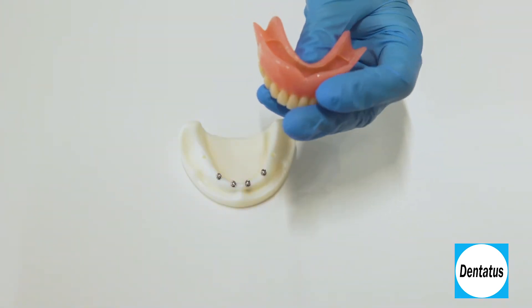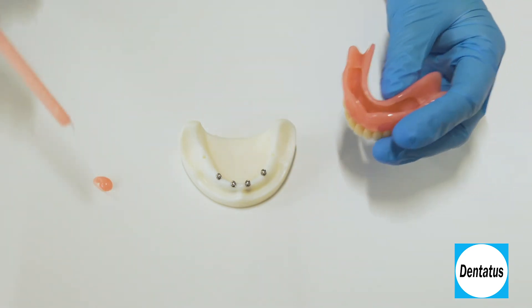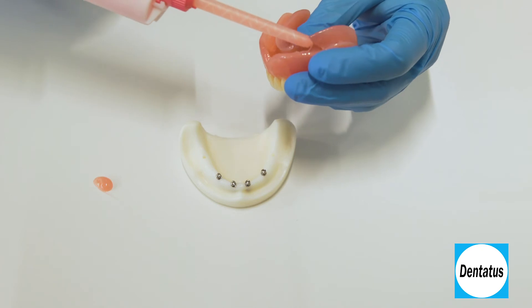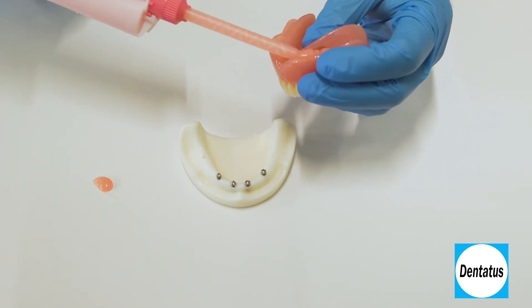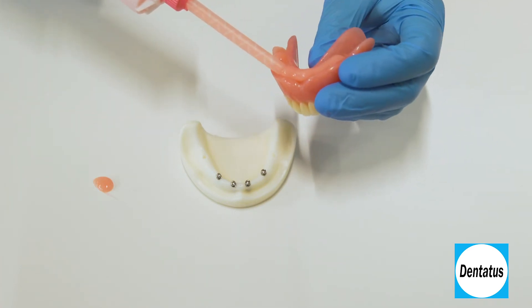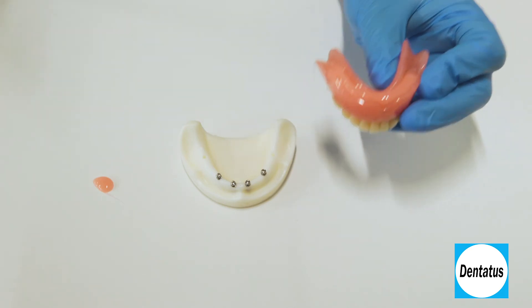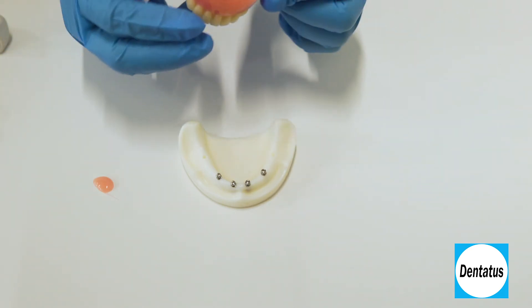Once the denture is seating passively, clean it of all debris and then dispense TuffLink into the relief portion of the denture base — first into the openings provided for the implants, then along the encasement seam. Put a little extra to cover the heads of the implants with TuffLink to prevent air bubbles. For this technique, it's better to overfill because you cannot add to the material.